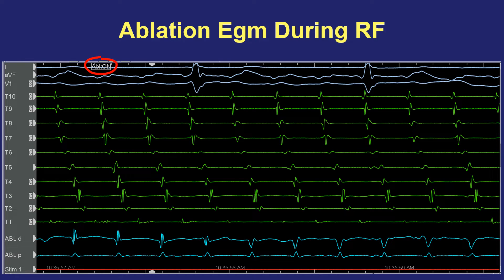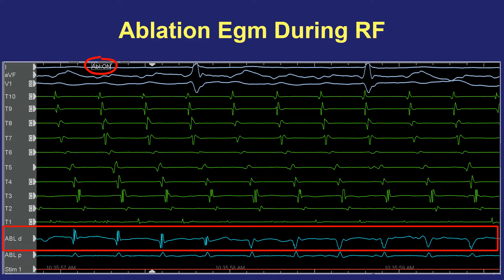Another way bipolar electrogram morphology is useful is during energy application. During an atrial flutter ablation, at the start of RF energy delivery there is a nice simple bipolar electrogram, but soon into the application the electrogram starts to become more rounded and lower frequency. When the bipolar signal starts to disappear and become very far-field-looking or lower frequency, that indicates successful destruction of myocardial tissue and may prompt earlier termination of energy application.